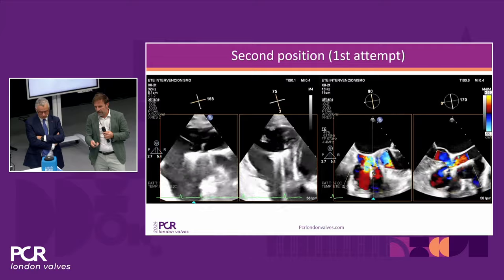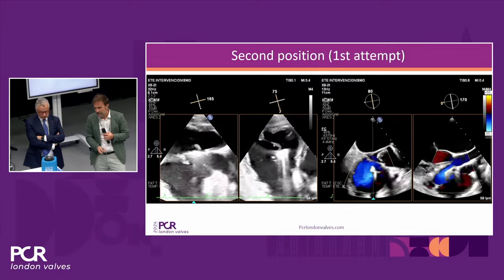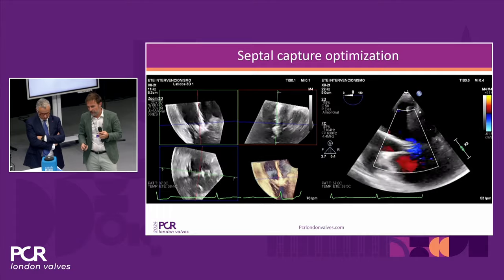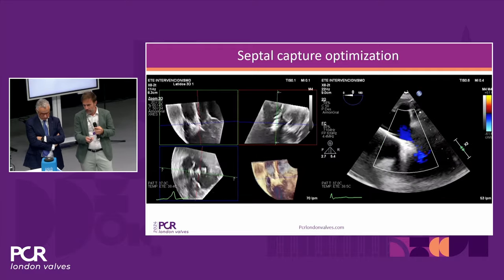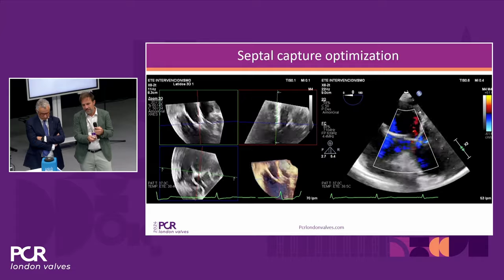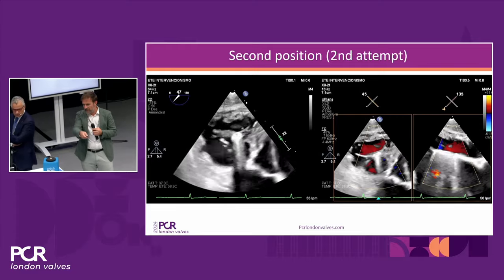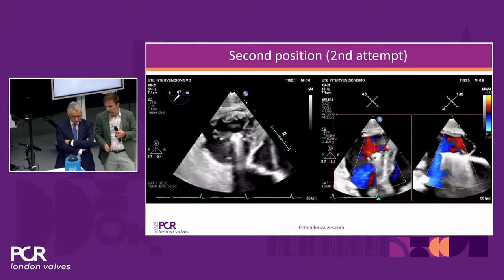So we got there, we have a good grasping, but the problem is that we are still having some residual regurgitation, as you can see. But if you check, probably the reason is that we are not catching the septal leaflet properly. One of the advantages of the device is the individual grasping. So we kept the lateral because we had a good amount of tissue, and we went a bit deeper towards septal, bending the catheter a little bit, and with that we got a better grasping. Once we are there, we had a good catch. Even without the color, you can already see a nicer pyramid on both sides. And with that comes the reduction of the TR, clearly with almost no MR, no TR.